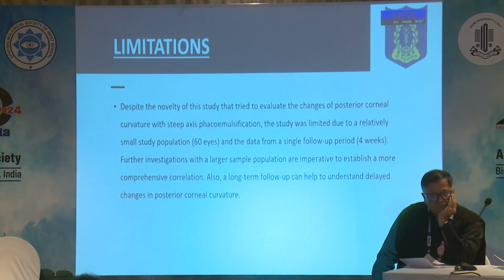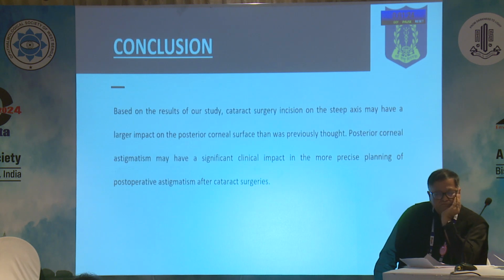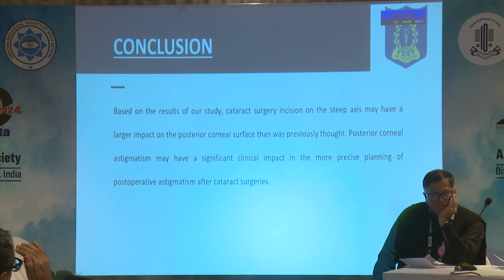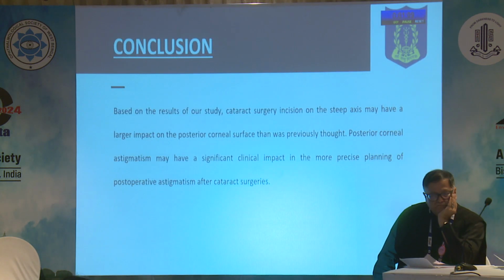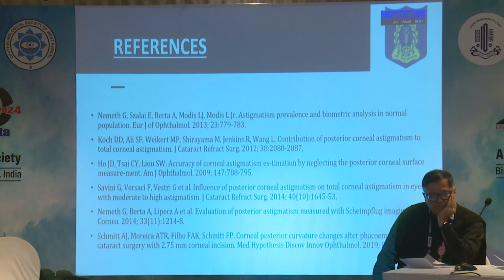Now, this was a single follow-up study, and there was a small population, so this has its own limitations. Probably a long-term follow-up study will be required to conclude the concrete data. So based on the results of our study, we can conclude that the steep axis may have a larger impact on the posterior corneal surface than was actually thought, and it may clinically impact the more precise post-operative cataract surgery planning and astigmatism correction. These are my references. Thank you.